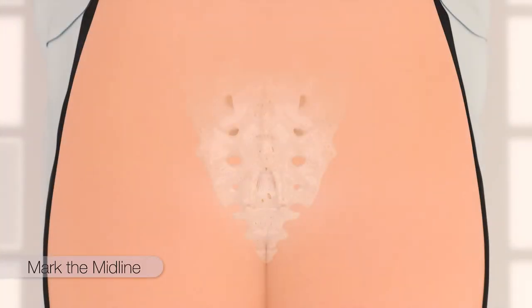After prepping and draping the sacral area, the patient's midline is marked by identifying the spinous process. The level of S3 is identified by palpating the tip of the coccyx and measuring 9 cm cephalad. This is marked with a transverse line. The needle entry points are marked by measuring 2 cm lateral and 2 cm cephalad on both sides.